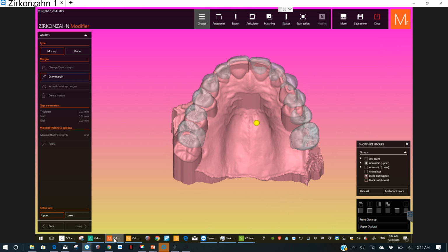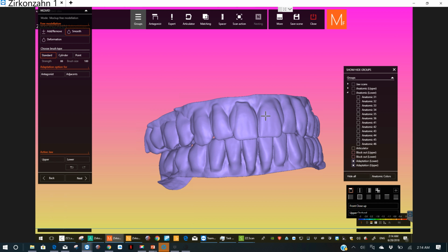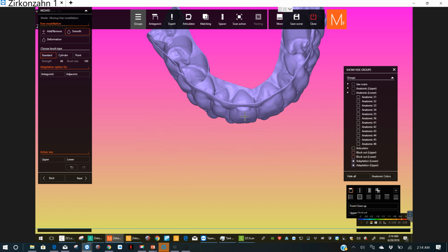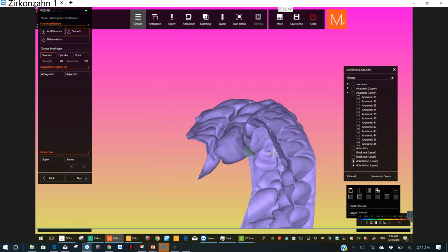So if you remember, what we're aiming for here is I don't want to necessarily scallop around the teeth too much. It makes it a lot more chance of error when you're making it. And this would just be easier to print and mill, and we could quickly cut that out if we wanted to, but I think we're going to want the strength there, or if we decide we want to add something. So it's no big deal to have that. We can cut it out quickly. It gives us a good idea, and it keeps the thing from breaking apart in your hand.